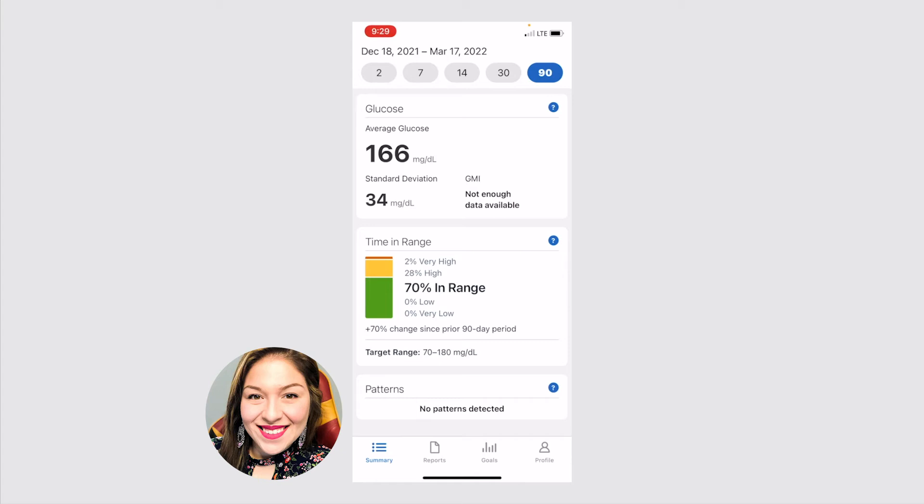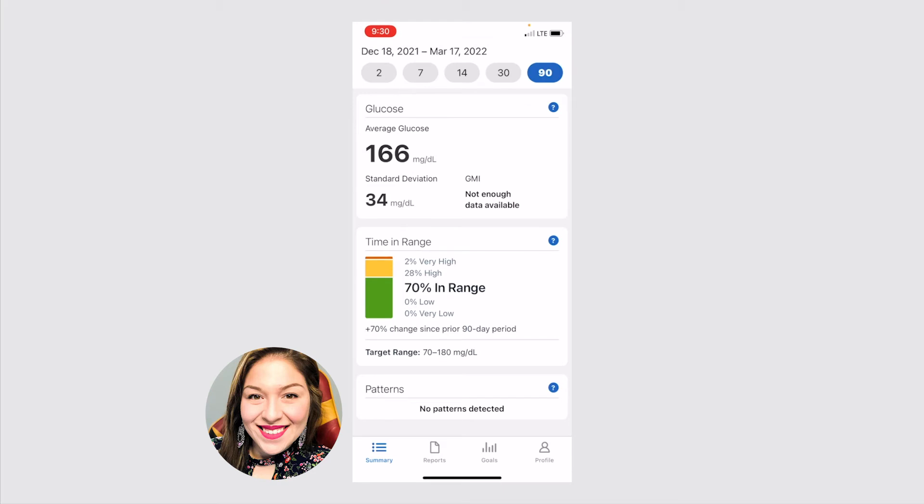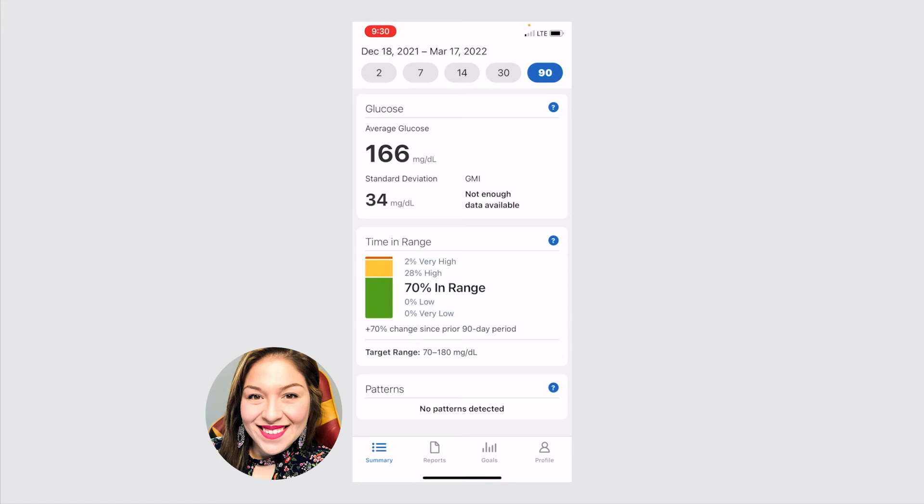It also shows you your time in range. So what percent of the time were you within the range that you set, again, that you want to discuss with your healthcare provider. And so mine, my target range was 70 to 180. So I was within that range 70% of the time. I was above that 28%, and I was really above that for 2% of the time. This is the information that you'll talk with your healthcare provider about to make those decisions on whether or not to make any adjustments.